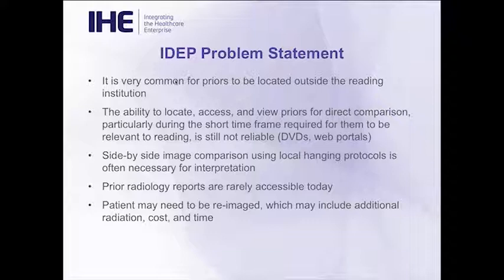Often radiologists are going to do measurements. They want to use the measurement tools that they're used to, so they want to also use the hanging protocols that they're used to on their PACS system, so side-by-side comparison is often necessary for interpretation. Even if a DICOM DVD or DICOM CD or web portal is available to view the radiology images, often the prior radiology reports aren't accessible today, and that's a goal that we also have for IDEP, which is to include not only the images but also the reports.